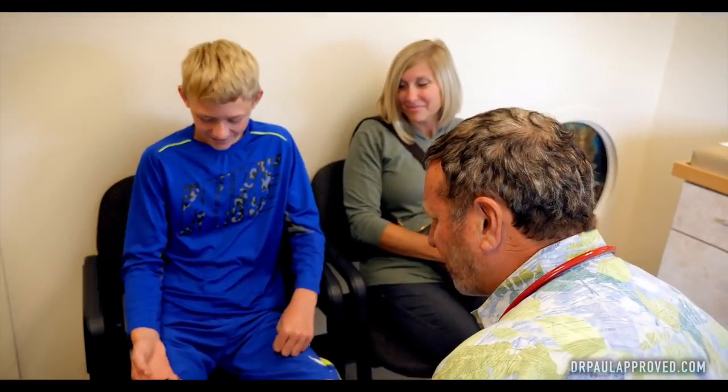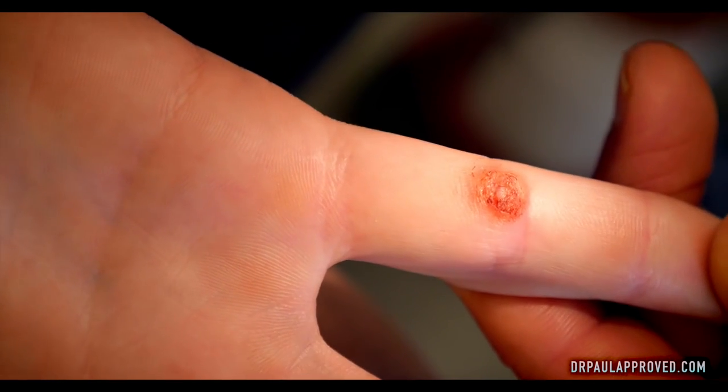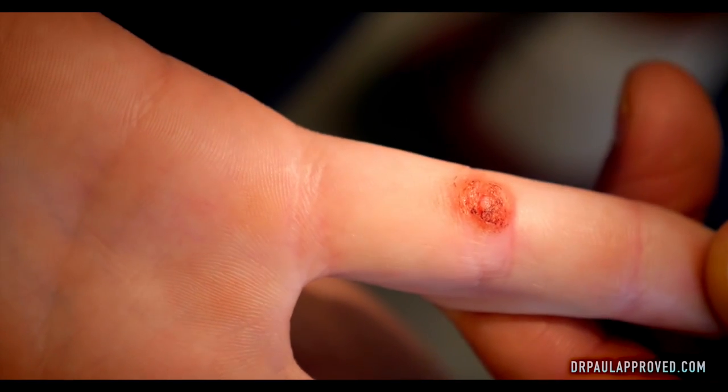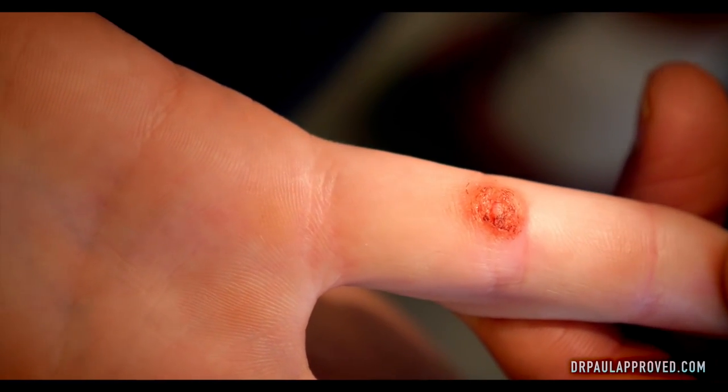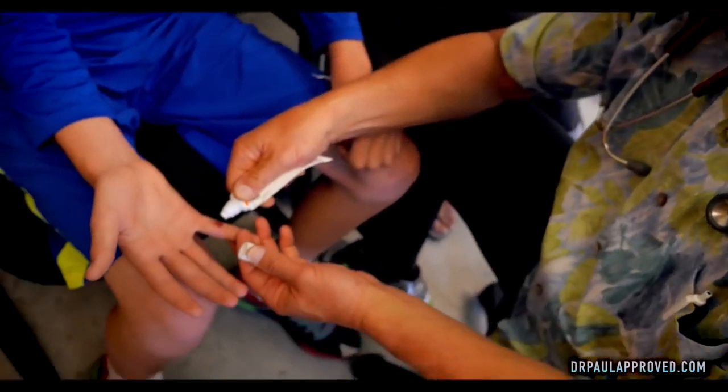So, I understand that you've got something on your finger I'm supposed to look at. No harm done — you might have been picking at it. And it's been frozen like four times? Oh really? Sometimes those home freezes just don't get a deep enough freeze.